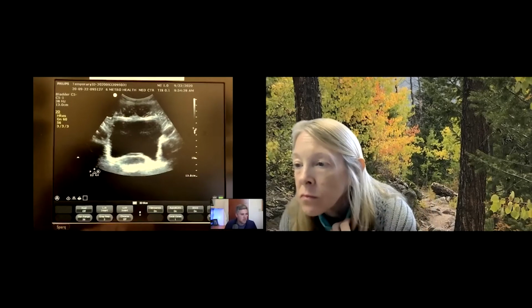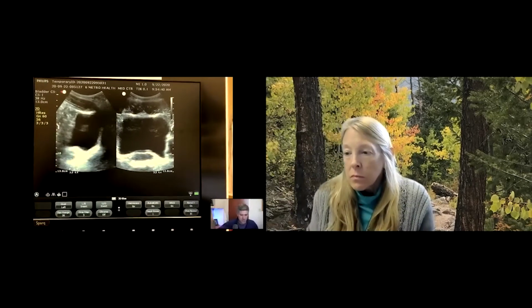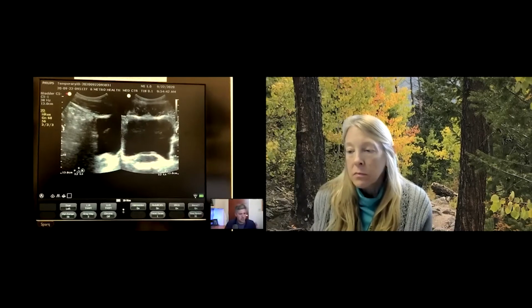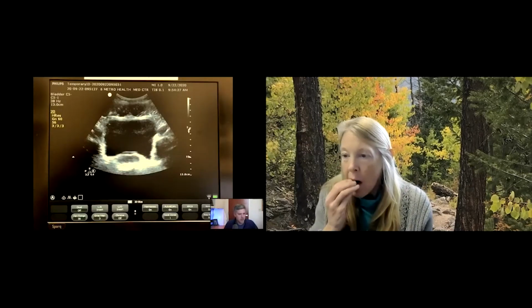And so what you'll do is you'll scan and you'll get these measurements. The way I like to do it is I like to use the dual function of the machine because it puts both images on the screen at the same time. I don't have to flip between images and mess something up. So in this situation, I'll replay that one real quick.